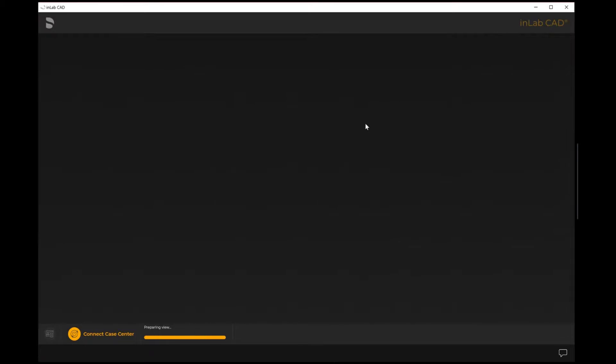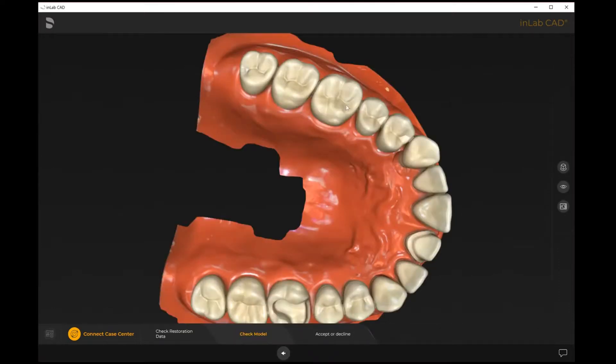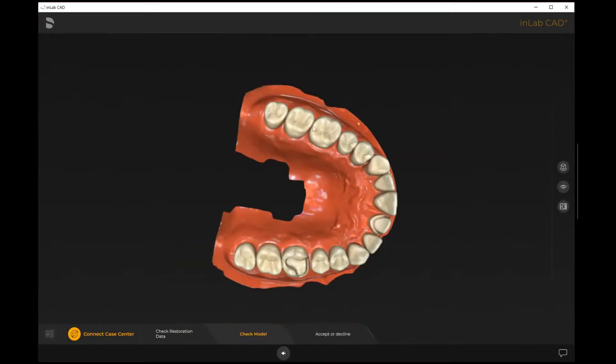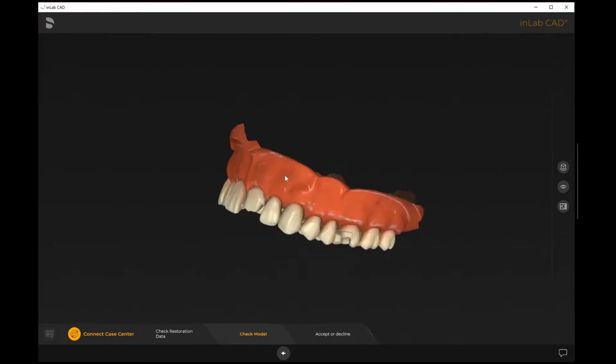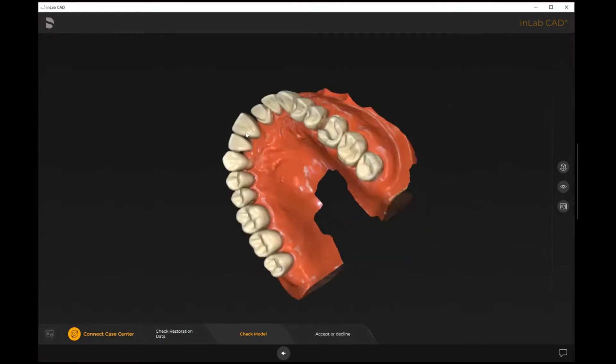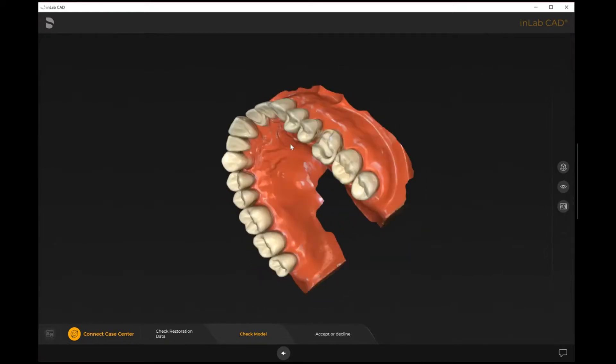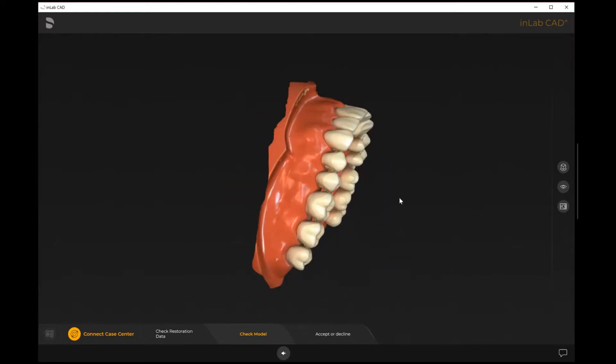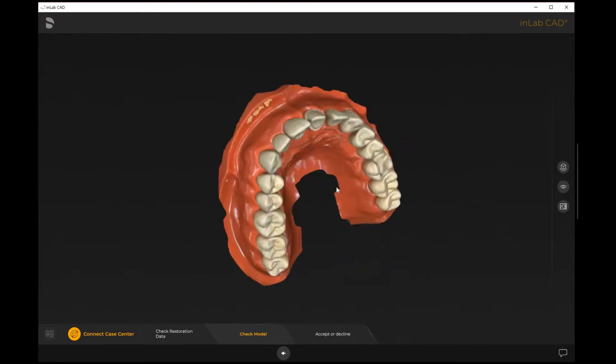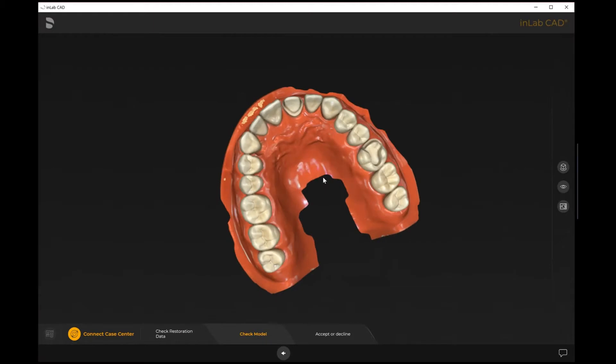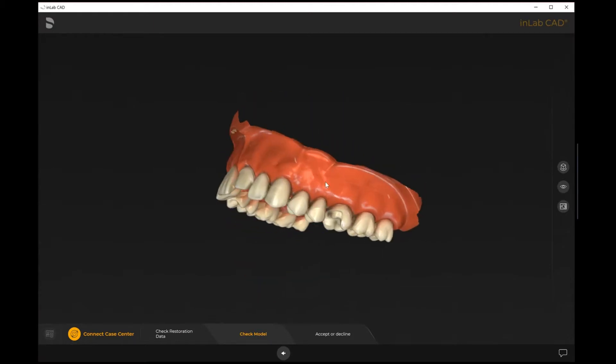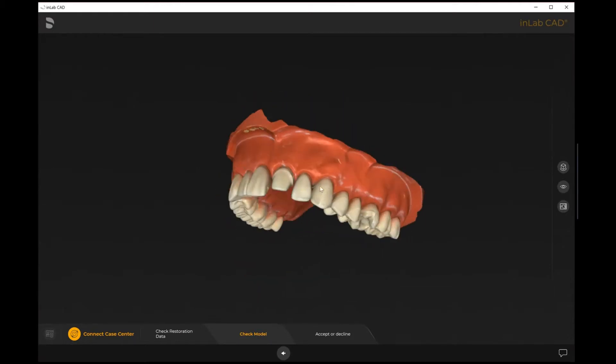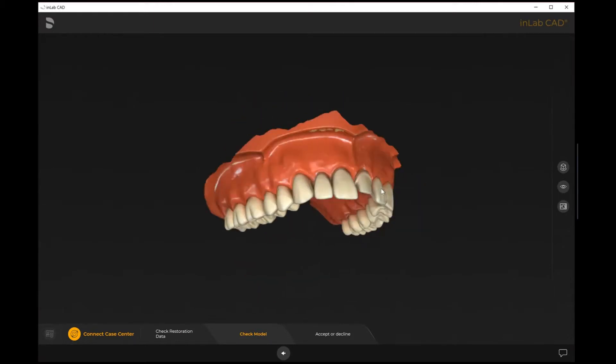Once it's getting to the prepare view, it's going to allow us to see the impressions here. We can isolate just one arch or we can add the upper and the lower or any additional files that the doctor has sent. The idea is at this point we will know have we got enough information for the case in question.